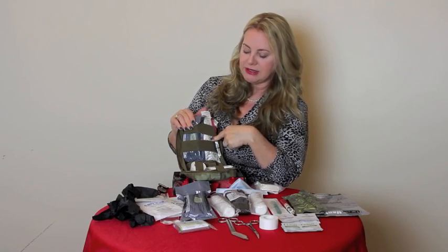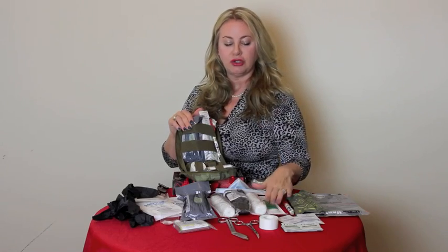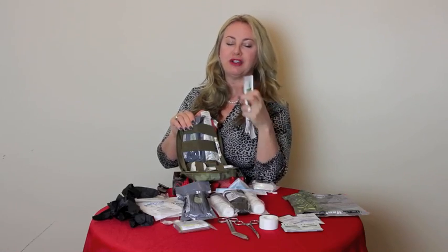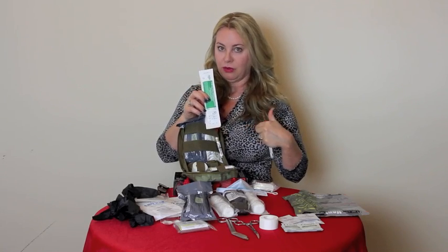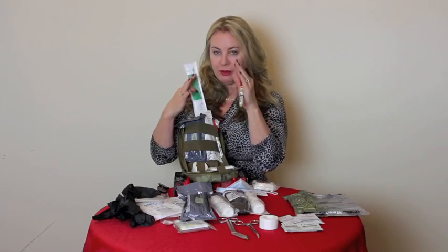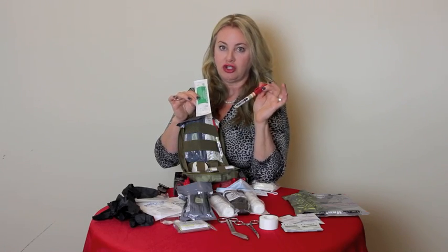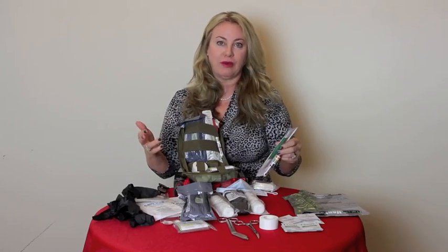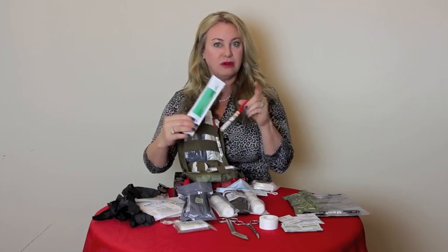The next thing you'll find in here is a number 10 scalpel. Now, this can be used to make a hole for your decompression needle. These are specialized pieces of equipment. You need to know what you're doing. You need to know how many ribs you're going down, where you're going in between, the exact alignment of where you'll be puncturing this. This is not something that a layman or someone who is not medically trained should be attempting. So if you've got the training, you've got the equipment, perhaps there's someone around you that does have that training. And so you can say, here, I have what you need. So that's why this is in here.